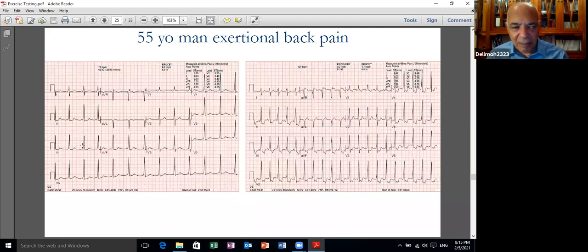So it moves posteriorly or inferiorly. And at the same time, it's negative in AVL. So it's moving from the lateral part of the left ventricle to the right side of the heart. So it's an anterolateral left ventricular accessory pathway. Being away from the AV node, because in the lateral part of the left ventricle, the impulse reaches the AV node easily. So it passes from the supraventricular to the ventricular compartments through the normal pathways, and a minor part of it goes to the accessory pathway.